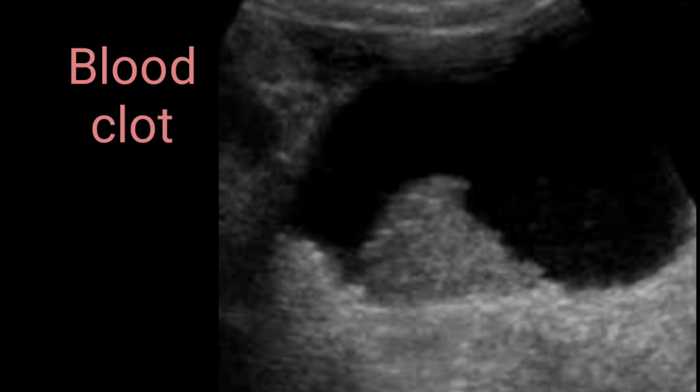Although it looks like a polypoidal lesion, or you might consider it as a growth or mass, a urinary bladder mass which resembles transitional cell carcinoma, be careful when you are differentiating between both. One is a totally benign entity and the other is a cancerous entity. So always use this maneuver to confirm between the blood clot and the mass. So this was confirmed to be a blood clot. Previous investigation and instrumentation history also confirmed that this patient had a blood clot within the urinary bladder.